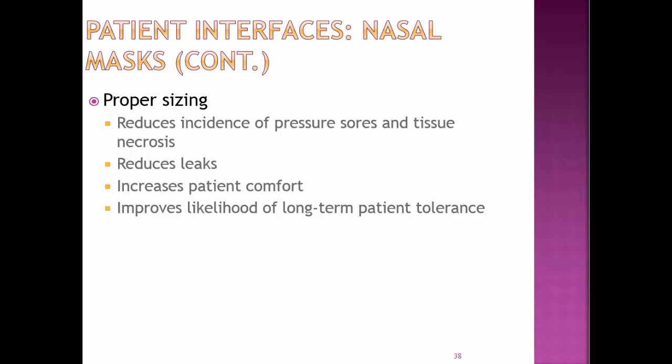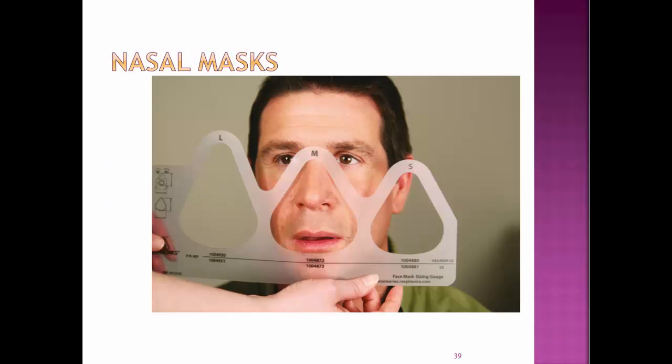There are a number of different masks, and finding one that's comfortable is a challenge. The one that I have at home is much more comfortable than the ones I see in the hospital setting, so it may be that they want to bring their own mask from home if you see these people in the hospital. This is figure 45-5 on page 1143 in your text.